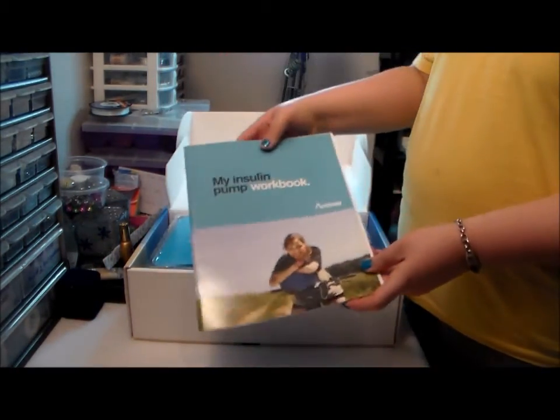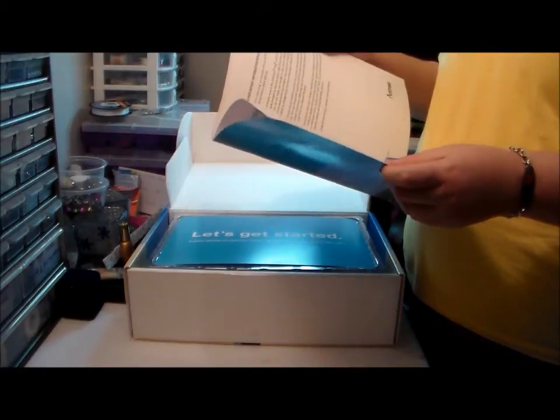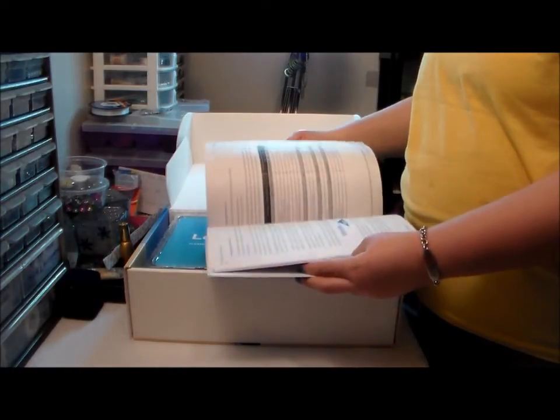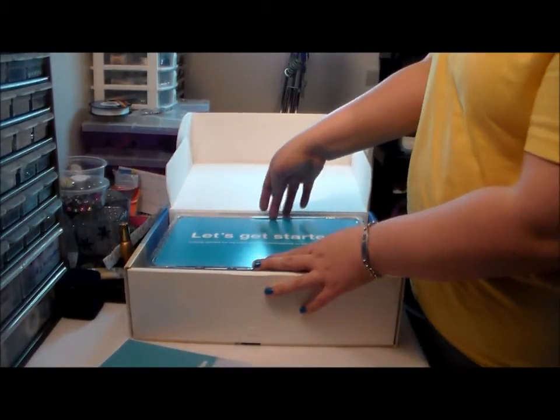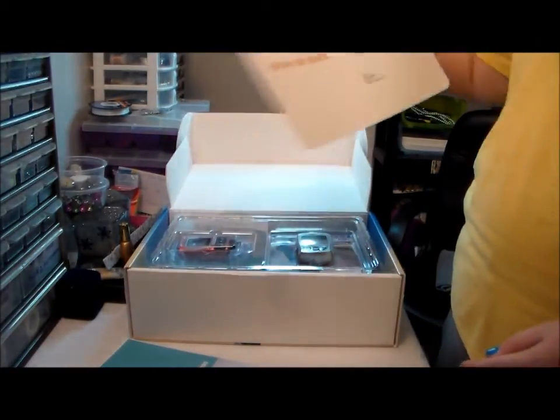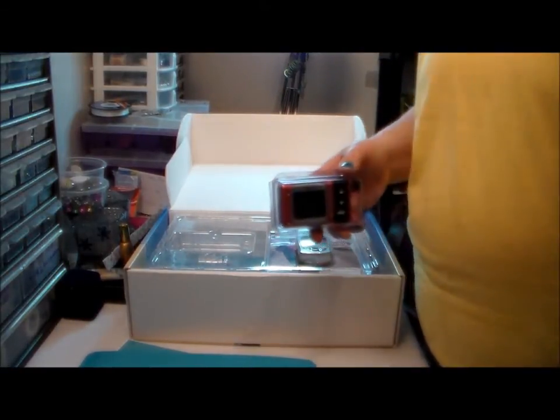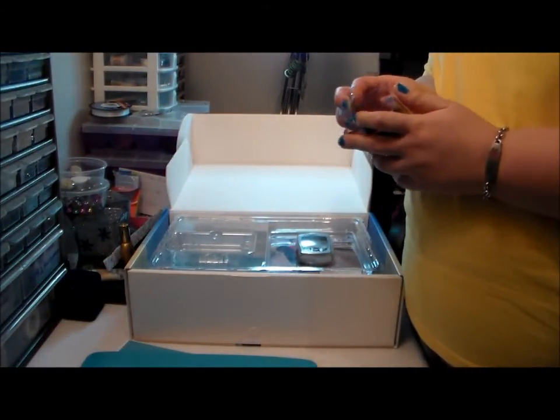It comes with my insulin pump workbook. I guess I've got to read through it. Okay, it says: 'Please review the important safety information on the back of this card.' And here it is. Is it me or is it just the lighting in here — this thing is like tiny.